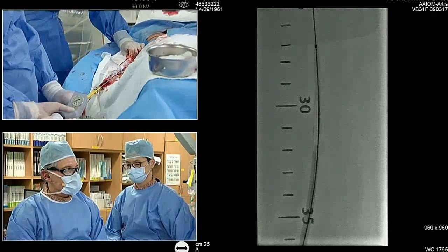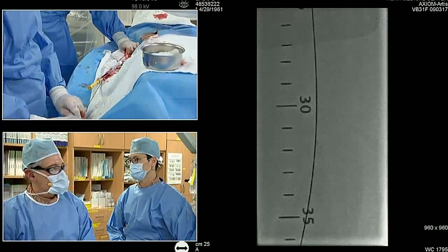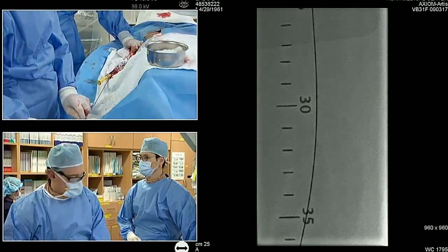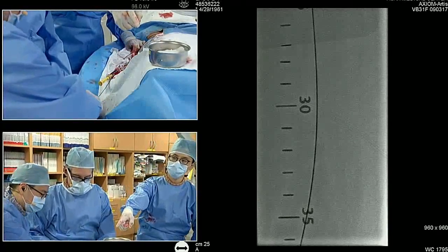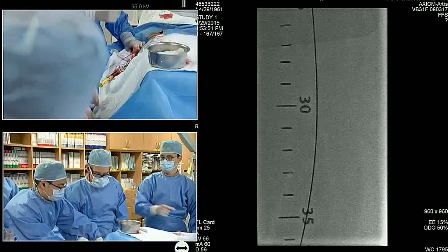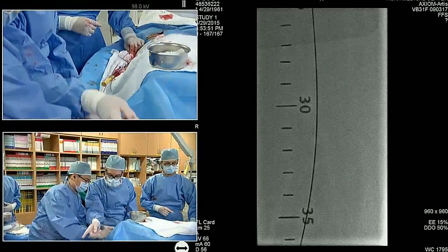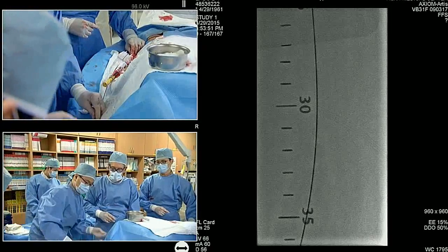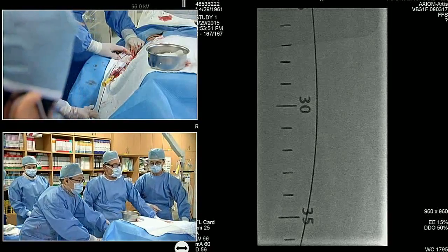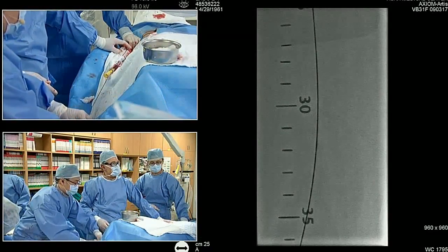We'll need at least one more of this length, and then the third one might be shorter. It's not fully deflated, suction. Use a syringe. Bob, are you going to spot stent on this one? Yeah, I think so. The origin needs it for sure. Yeah. So we'll look and see if any other segment needs it.